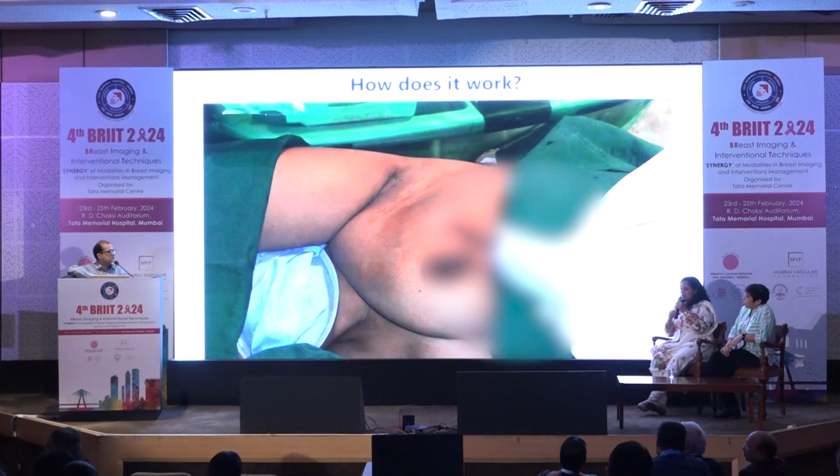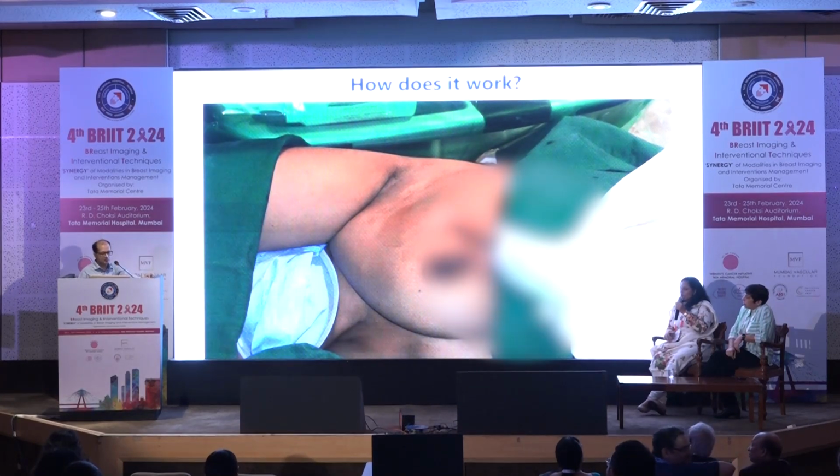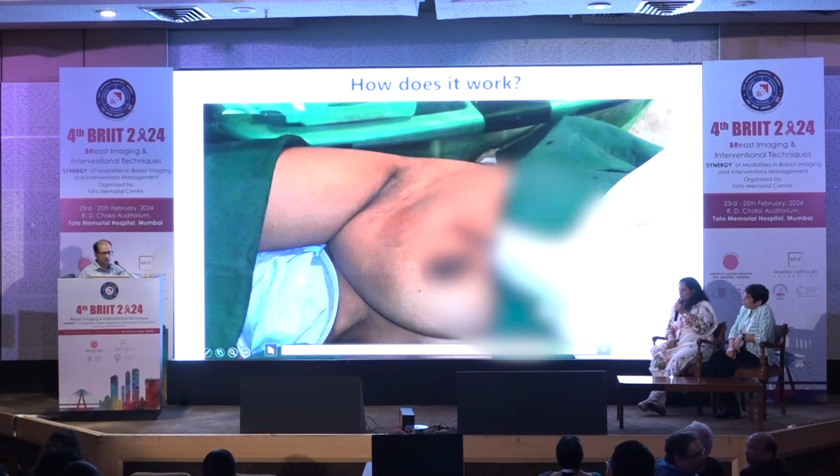And another thing is, you have used the BD VAB, right? So for a 5 millimeter lesion, you can use a half throw, as you are not suspecting a malignancy in this. Even for a 5 millimeter lesion, 1.1 centimeter will be the half throw aperture sample notch size. So we can avoid taking a lot of normal breast tissue for such a small lesion which has a very low malignant potential. Instead of using a full sample notch, you can use a half sample notch here, and take only that 1 centimeter component.